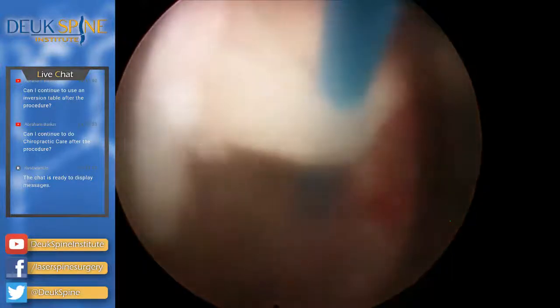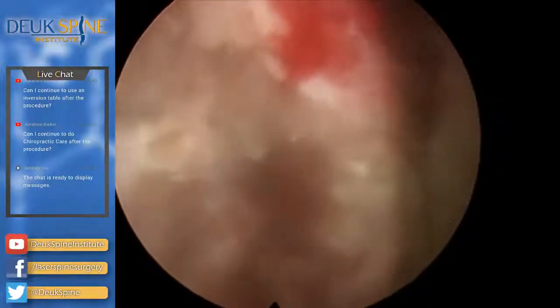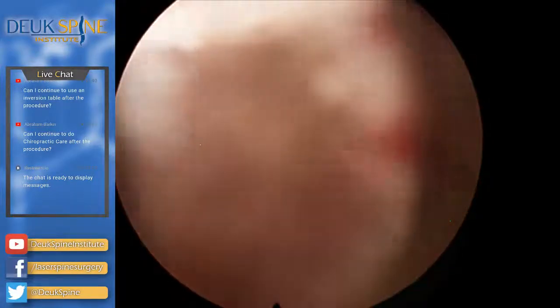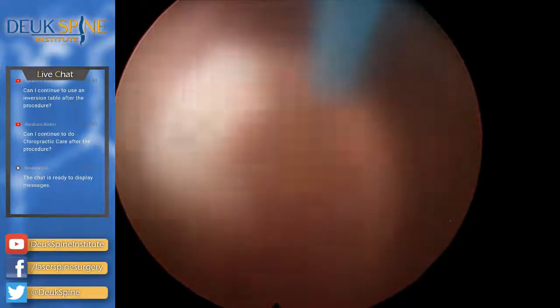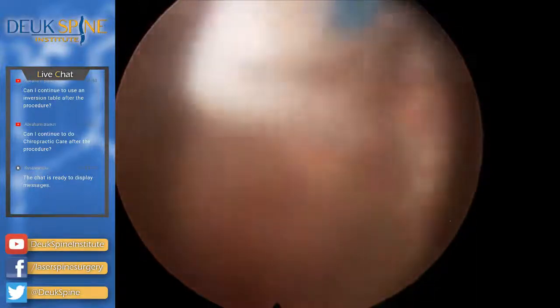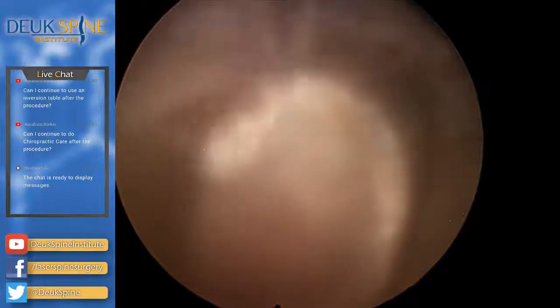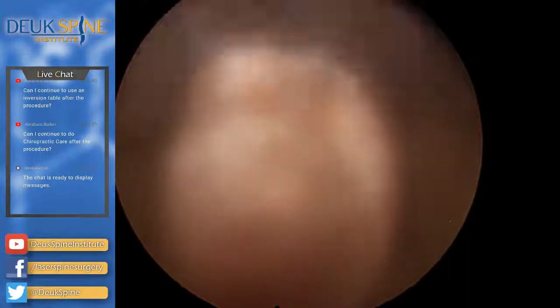That's about it. That's just some fat. I know it's hard to see, and I apologize, folks.